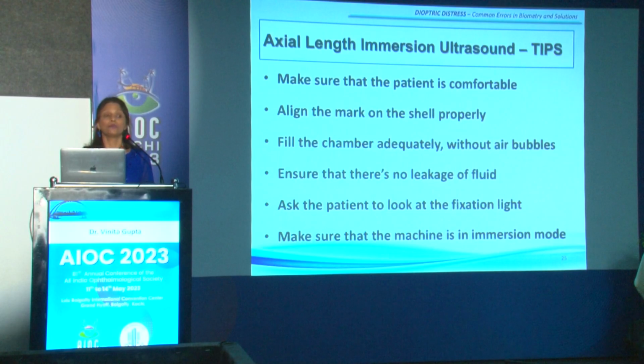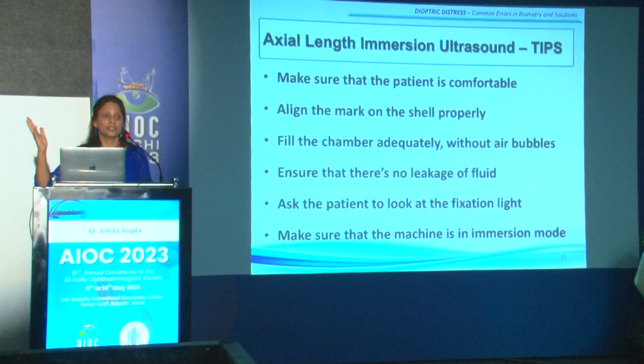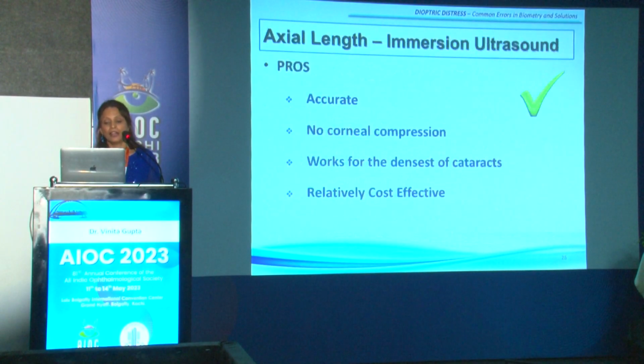and make sure that the machine is in immersion mode. This is the most important thing to remember. Many a times this happens that if your operator is running it, or if somebody else is measuring, your optometrist is doing it for you, he has not changed the mode from the contact mode to the immersion mode. And that will give you erroneous readings, leading to faulty IOL power calculations, and you landing up with a refractive surprise the next day itself.